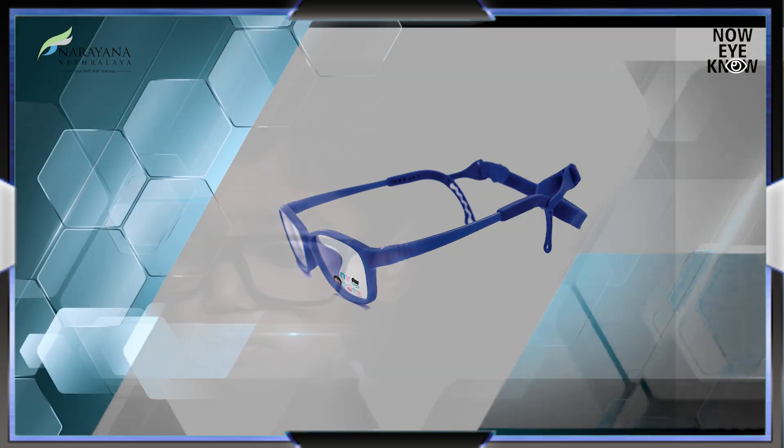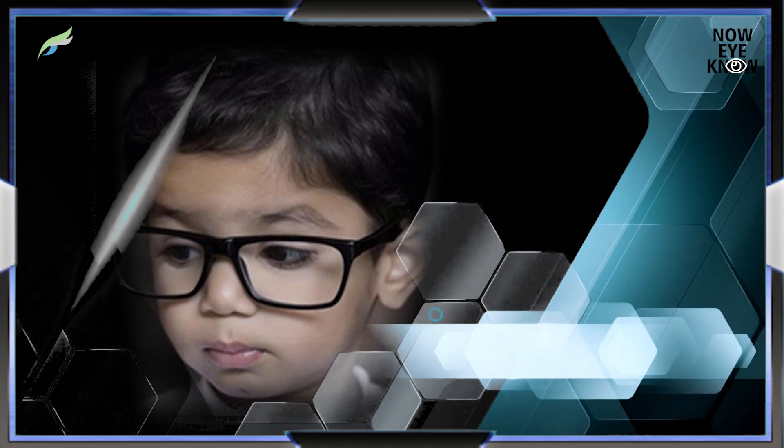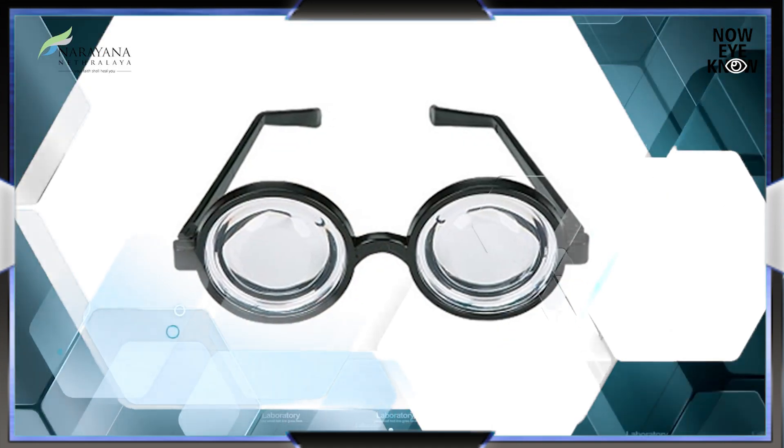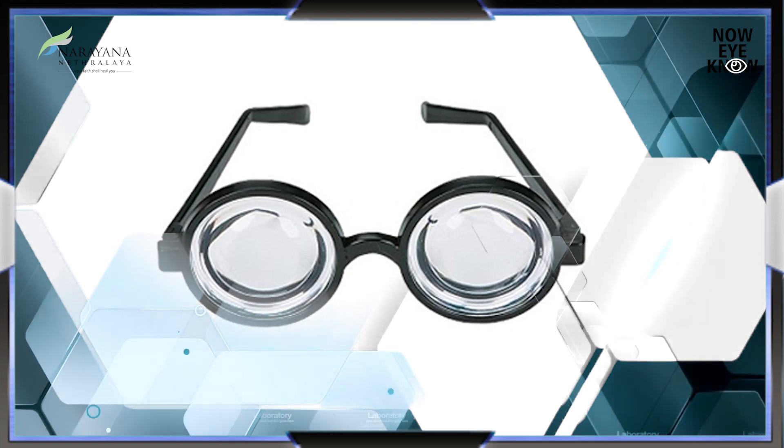This is a pediatric frame and this particular child has a very high minus power. This is what a high power lens looks like — the thickness can be this much.